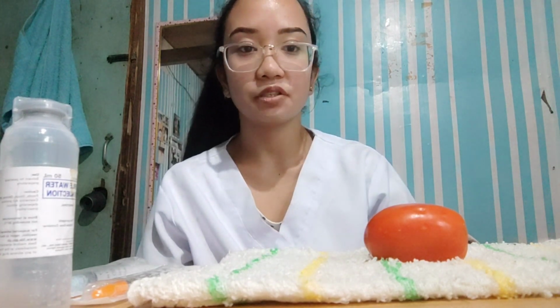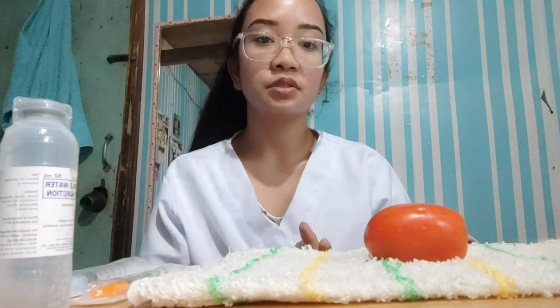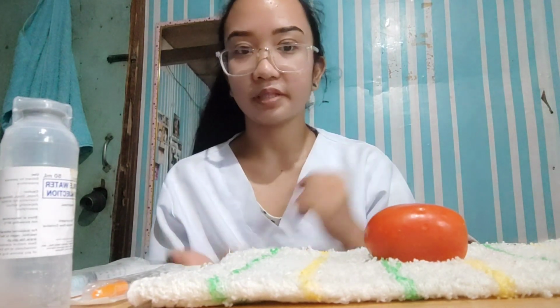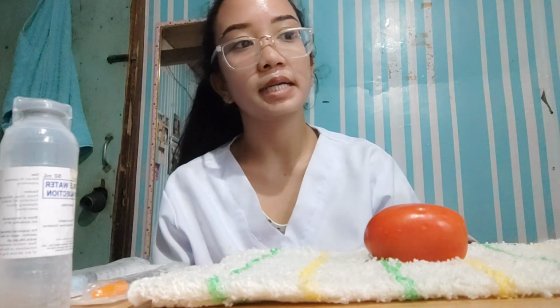I will be performing the parenteral medications, and these medications are given through a route other than the alimentary canal. These routes are the intradermal, subcutaneous, intramuscular, and intravenous.